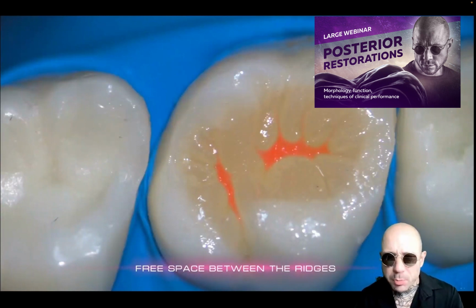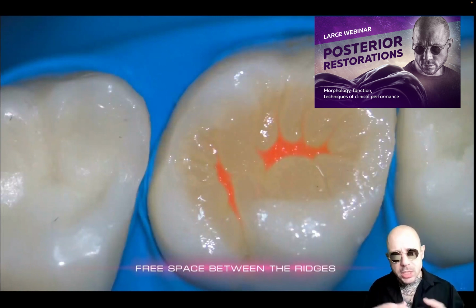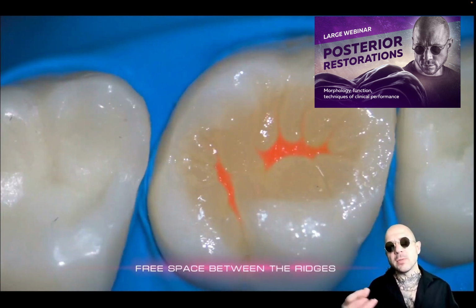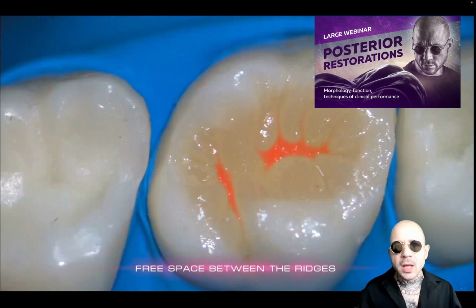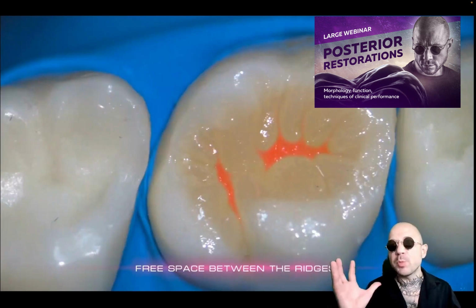So it's possible, but it will complicate the work highly. That's why I gradually bring the ridges into contact with one another, slowly, initially saving some free space between them.